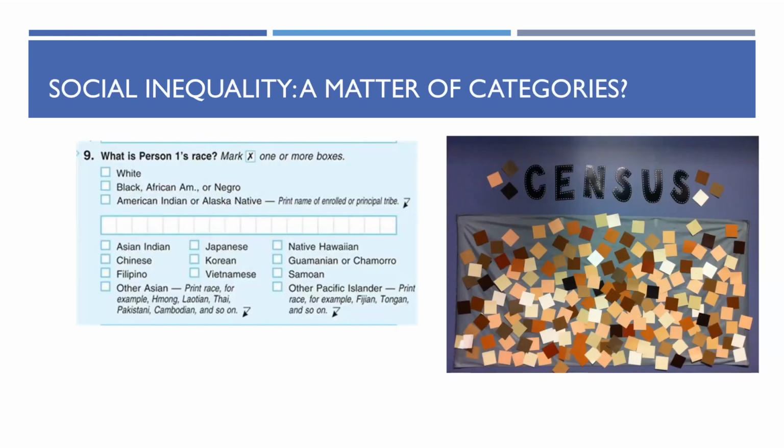So the kind of stepping point here is to say that on one hand, we have a lot of studies that use racial categories and then make claims about skin tone and pigmentation as potential issues with pulse oximetry. But what I'm trying to point out here, first of all, is that belonging or ascribing to a particular ethno-racial category on the census is not the same as skin tone itself, okay?